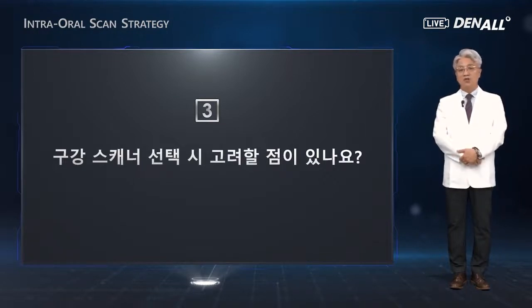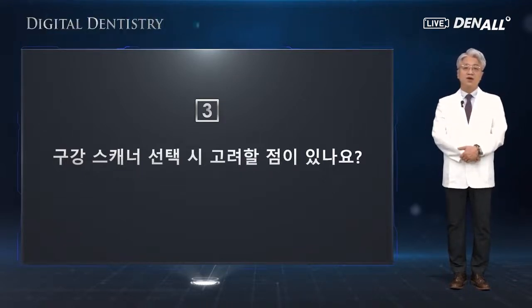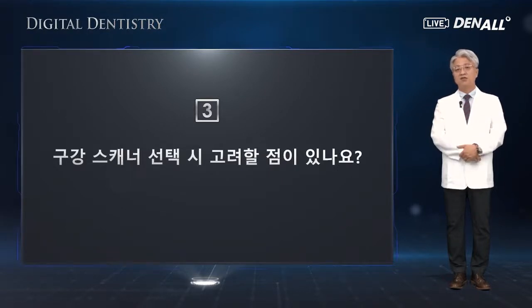If the scanner runs very slowly or it takes a lot of time for post-processing, it will be very hard for the dentist as well as the patient. So you'd better choose a scanner with better performance.